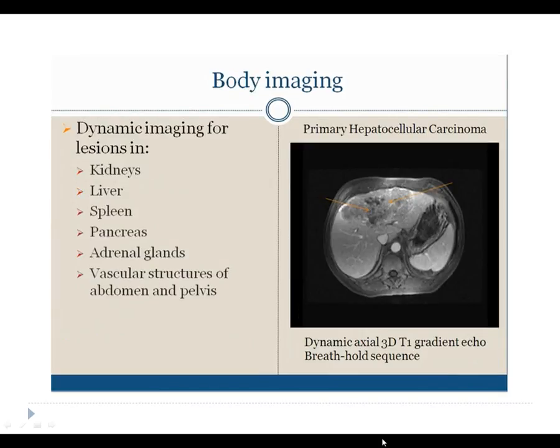Many abnormalities in body imaging can be seen on the T2 weighted image, but the use of a contrast agent in MRI allows for the visualization of extremely small tumors and improves delineation of tumors' edges or margins.